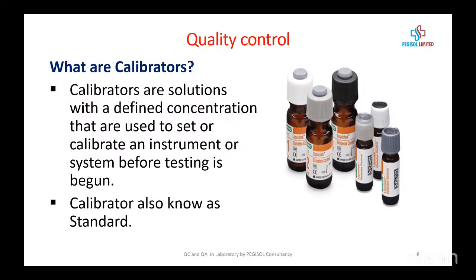Now, what are calibrators? Calibrators are solutions with a defined concentration that are used to set or calibrate an instrument or system before testing is begun. Calibrator is also known as standard.